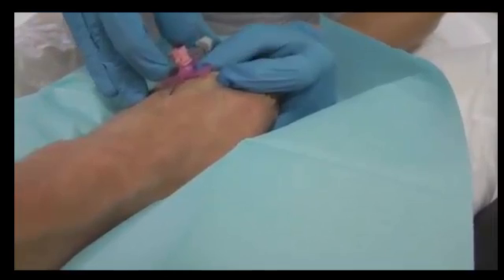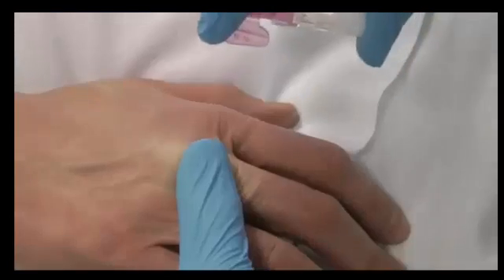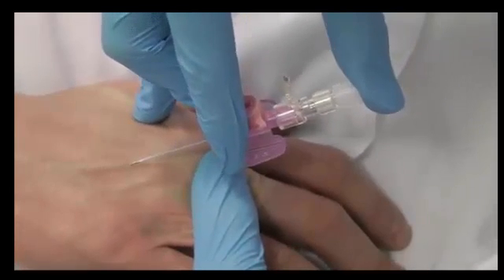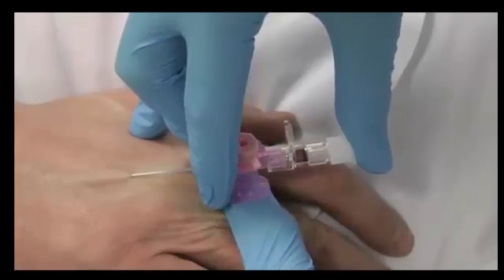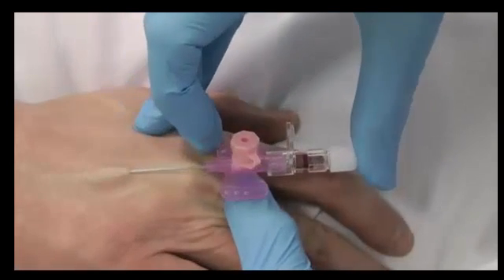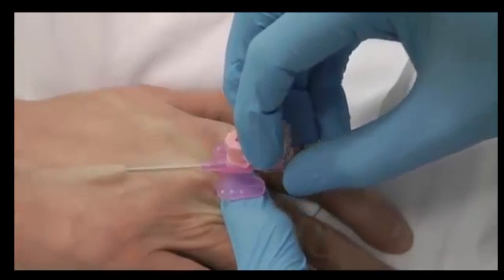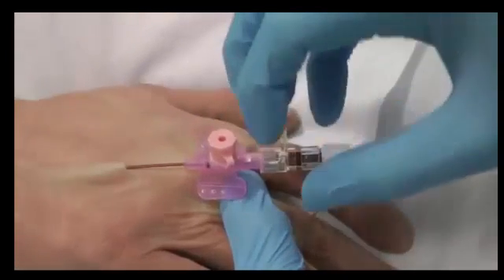Gently advance the stellette of the cannula. Warn the patient of a sharp scratch on insertion. Observe the first flashback of blood in the chamber of the cannula. Retain the tension of the skin and observe the second flashback along the tube as you advance.